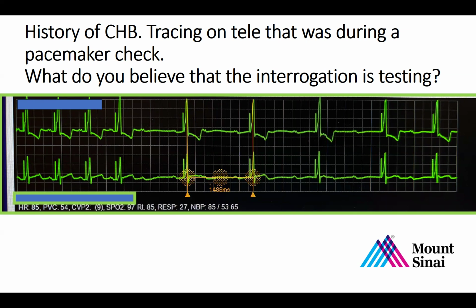I think it matters for AV synchrony. Well, but if you're not conducting virtually ever, and if the atrial rate is always what it normally is, let's say in a small child it's 100, then you know that your atrial rate is always going to be greater than 100. So you will always pace the ventricle at above 100. In theory, if you have complete heart block and your underlying rhythm is heart block at 50, you would never really lose AV synchrony without sensing. So why does sensing matter at all in a patient with a permanent pacemaker, you think?